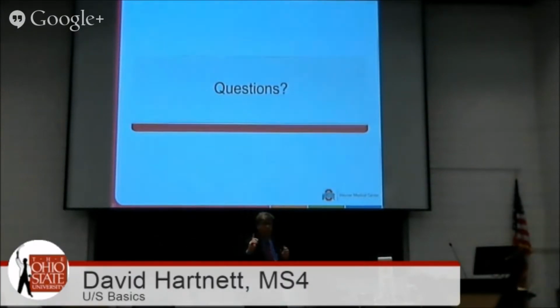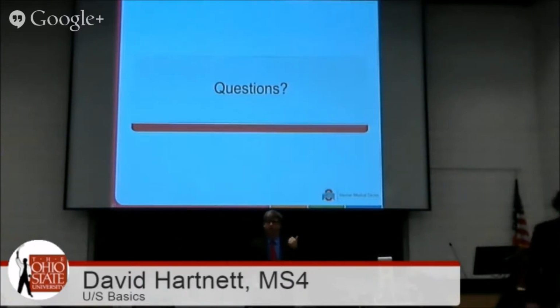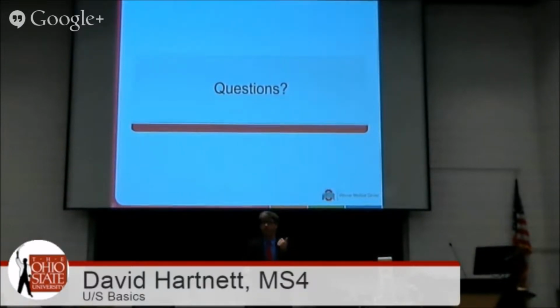So we're going to move over to the CSAC, but real quick, what are the three colors of ultrasound? What's black on ultrasound? Fluid or artifact. What's gray on ultrasound? Tissue or artifact. You see a pattern. What's white on ultrasound? Air is white on ultrasound.